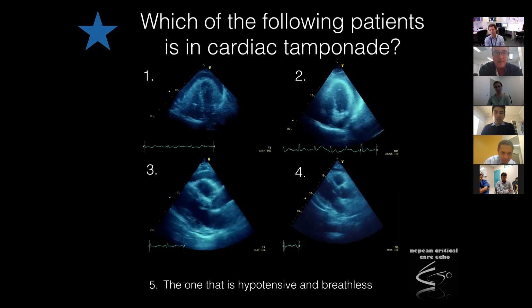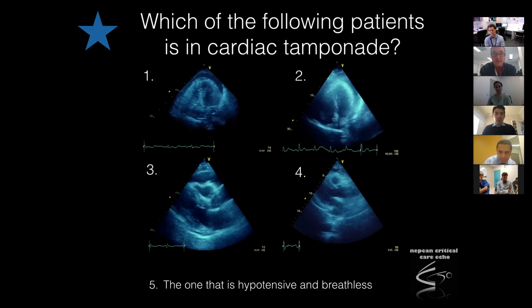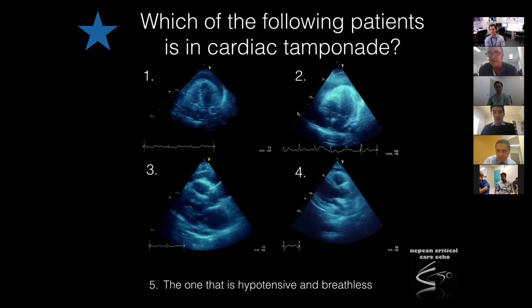And then we take a measurement of the maximum measurable distance, wherever that might be, in diastole. Very nice, end diastole, yeah, very nice.